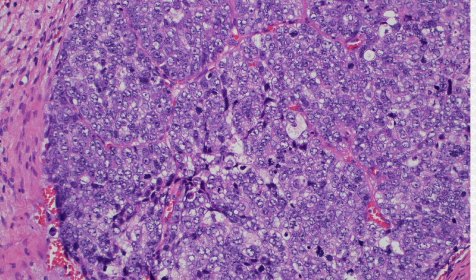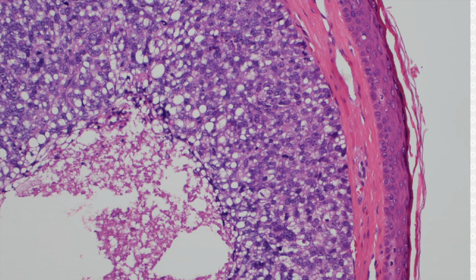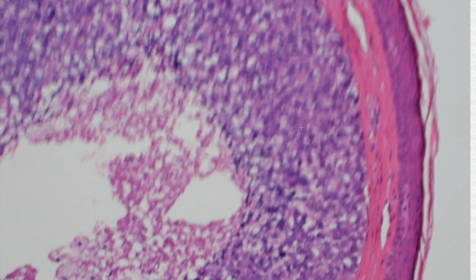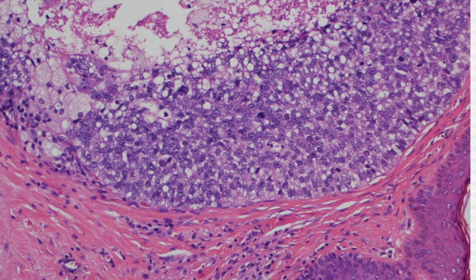Whenever you see a tumor that looks ugly and basaloid, if you're having trouble telling between basal cell carcinoma and squamous cell carcinoma because it's so ugly, always think of sebaceous carcinoma. Looking at this field, there's not really much obvious sebaceous differentiation. There may be a little bit of foamy bubbliness, but I don't see well-formed sebocytes. Here you start to get nice, obvious lipid vacuoles that indent the nucleus, although most of the cells are univacuolated and not multivacuolated.